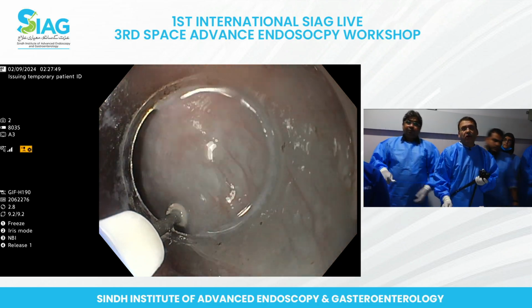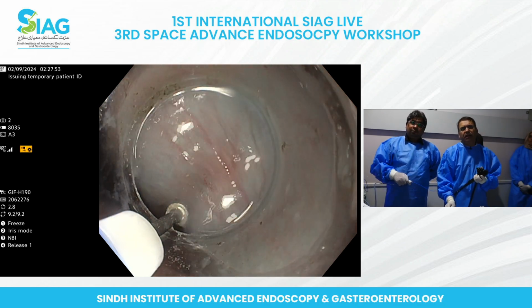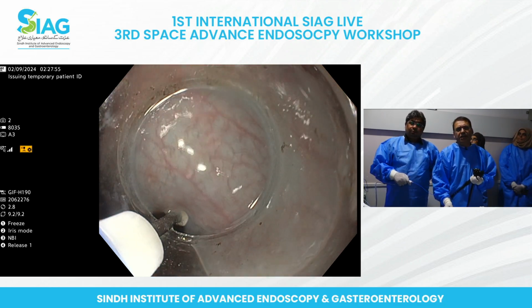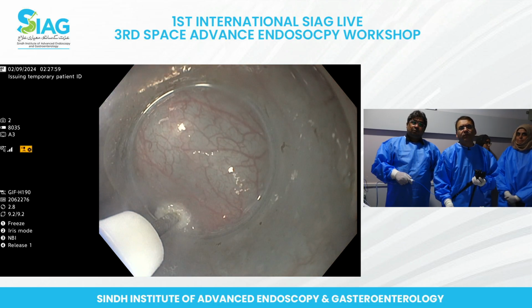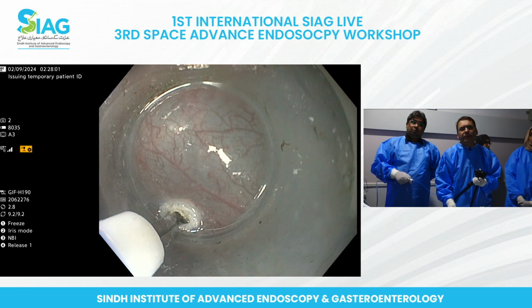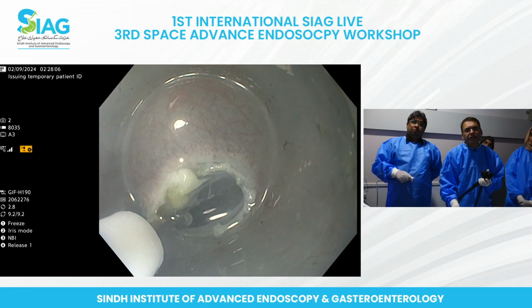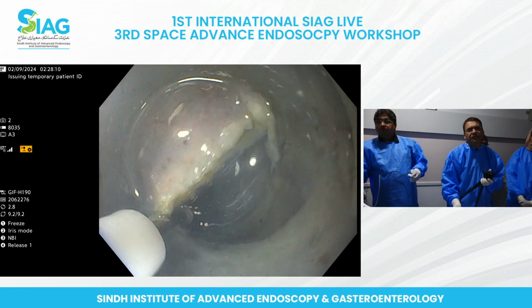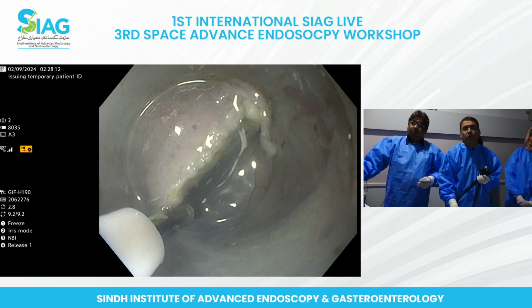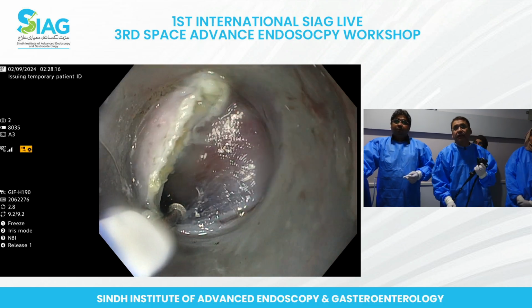Okay. So this is the anterior approach. That's what I explained earlier. What I'll do is, here I'll use a yellow paddle, and you see how it went in just with one tap. Now I will put a little bit of pressure and move down vertically down. You see that? And I see a submucosa inside. So we are good here. I'll do a little bit of cautery there on the side.